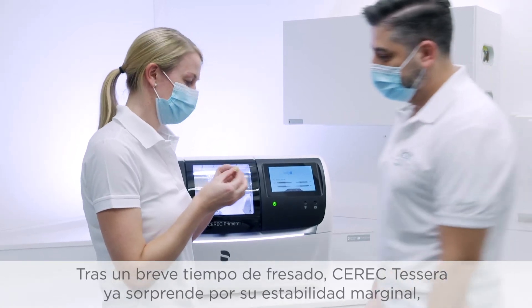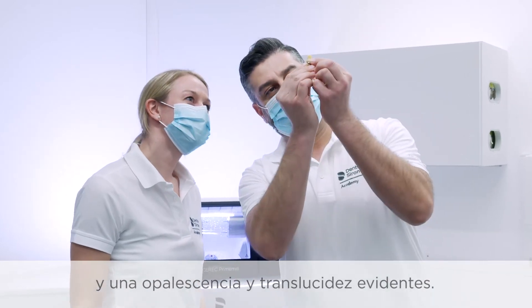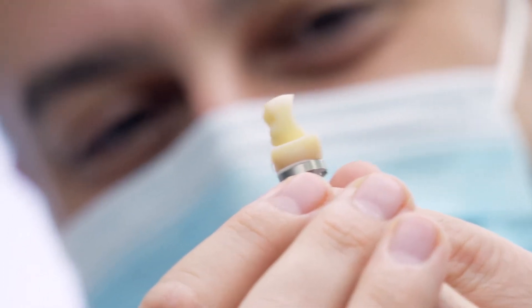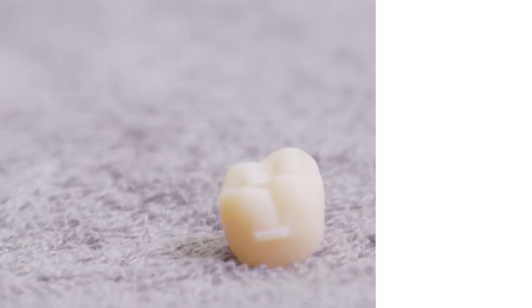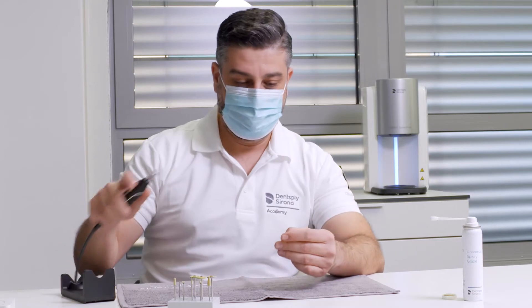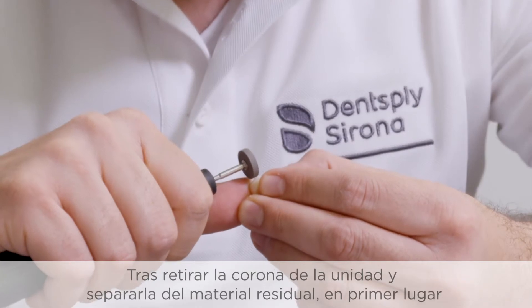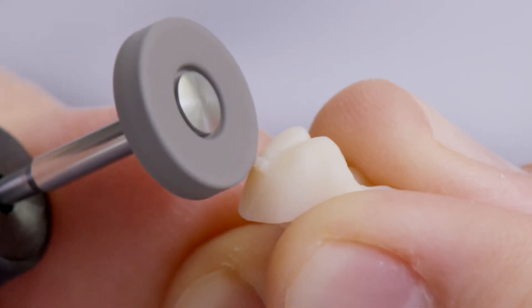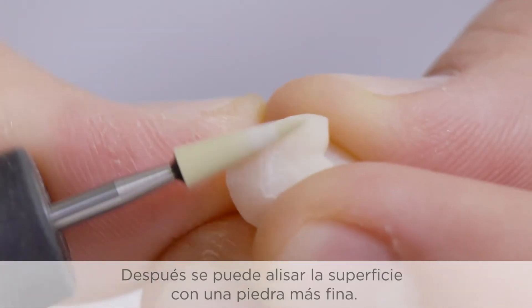After a short milling time, Seric Tessera already impresses with its marginal stability, obvious opalescence, and translucency. After removing the crown from the machine and separating it from the residual material, the sprue is first ground with a heat-dissipating, diamond-coated stone. The surface can then be smoothed with a finer stone.